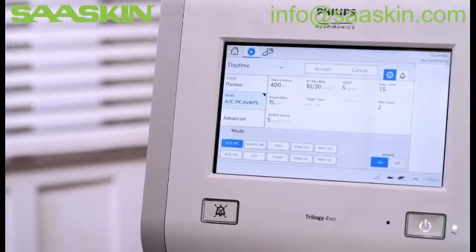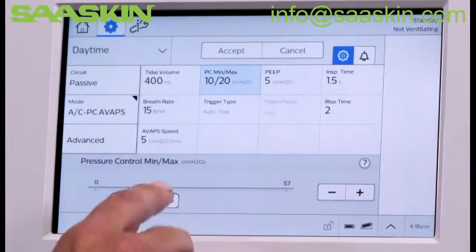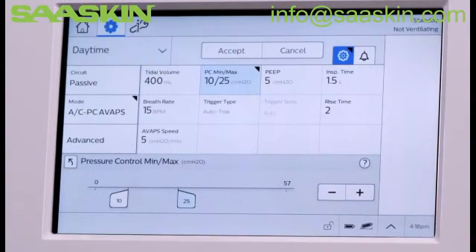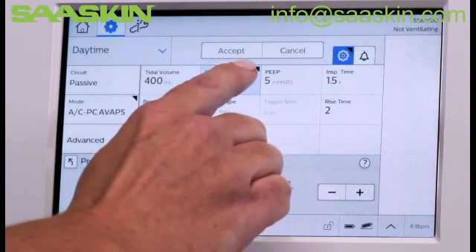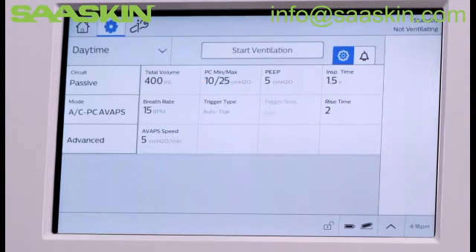Now we'll edit some of the prescription settings. Tap Pressure Control Min, Max, and use either the slider bar or plus and minus controls to adjust the setting. Once a parameter has been edited, a change indicator will appear in any altered setting box. To save the changes, tap Accept.